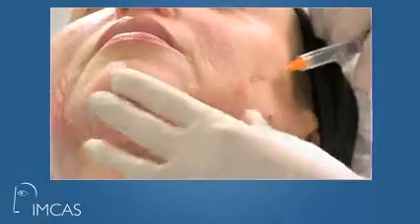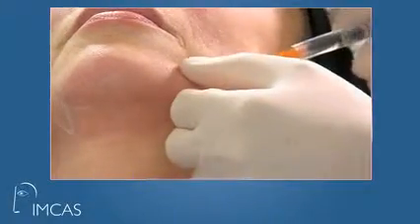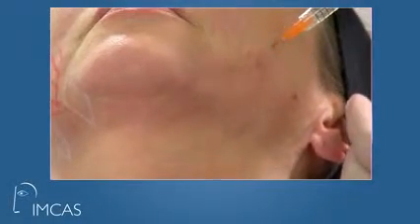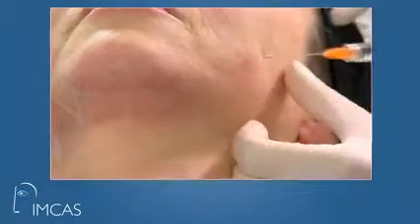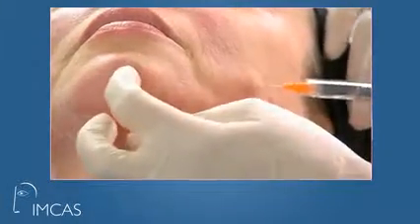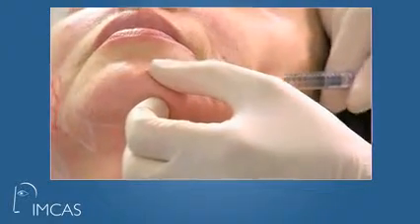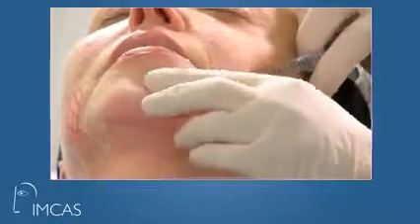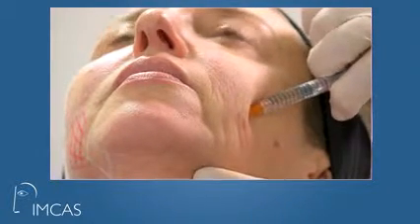Okay, now I continue a little bit in this area, just to continue to harmonize this line. Okay, I continue with Ultra Deep with the same direction of cannula, but I want to go into the middle of the chin. As you can see here, I am in the middle of the chin. The tip of my cannula is exactly in the middle of the chin. I create a projection.